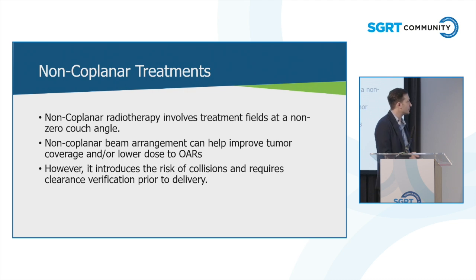With non-coplanar radiotherapy, you basically treat at non-zero couch angles. Your beam arrangement can help improve your tumor coverage, as David beautifully showed, and lower dose to your OAR. However, it introduces the risk of collisions, and you need clearance verification prior to delivery.